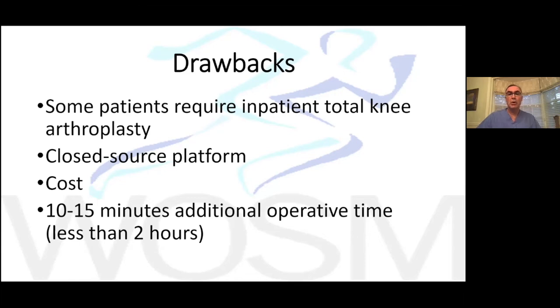Until there's a more open source solution, which I think the market will push towards, and I think that will be the long-term successful model, an open source platform where the same computer assisted robot will allow us to use different implants from different manufacturers and different patients for different reasons without having to go to multiple different computer assisted robots. These are very significant capital outlays for the hospital or for the system that is purchasing the computer.